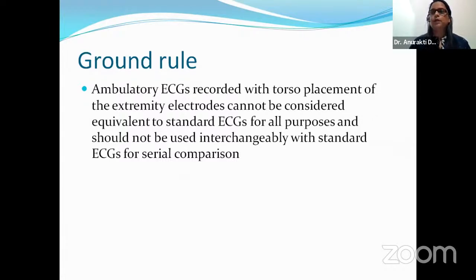and then he has some ECG from 3 months back, and we start comparing what happened then and what happened now. The processing of ECGs and Holter is totally different. We cannot use them interchangeably. It's not that this visit you used ECG, the next visit you used AECG, and the next visit you use ECG. If you're following up with ECG, you have to do ECG at every visit. Holter recording has a different set of data which you want to derive from. So you should order for Holter, but apart from that, you should have ECGs also continuously for follow-up. You cannot use them interchangeably.